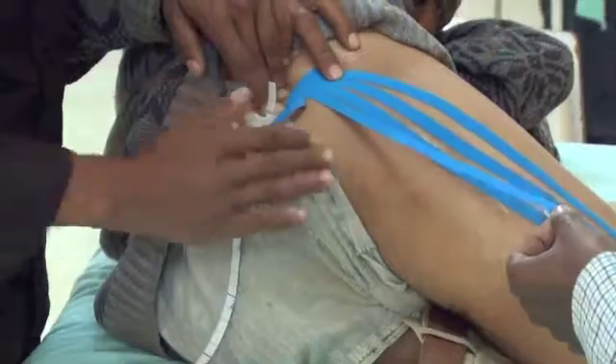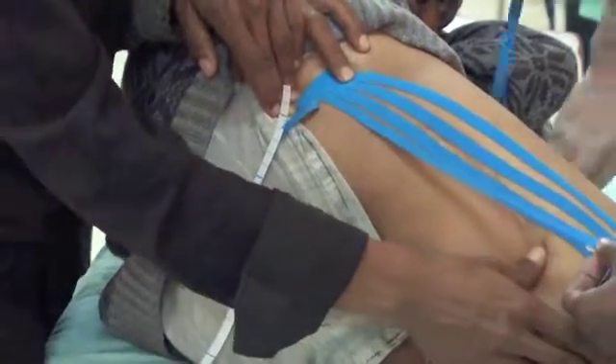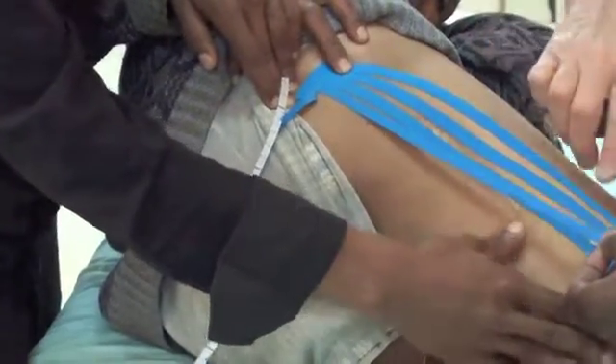Stretch up, stretch down. There you go. He will help. You don't stretch.